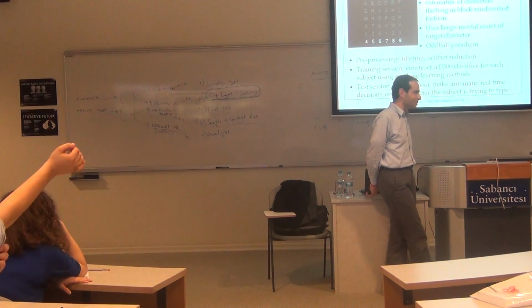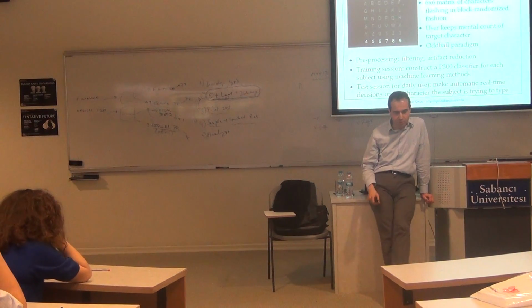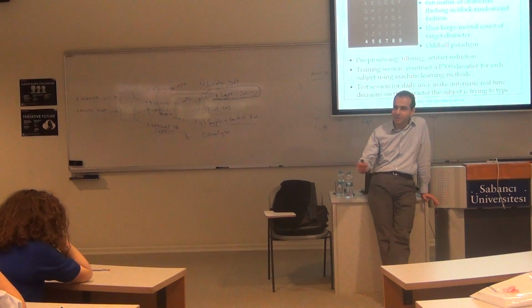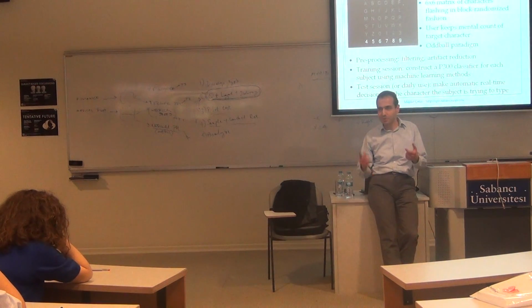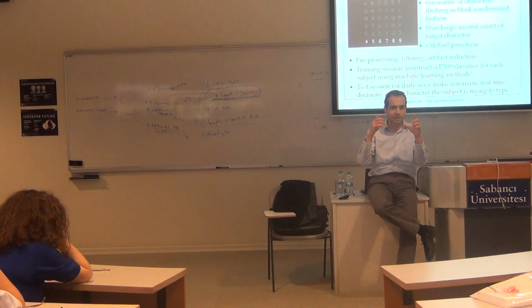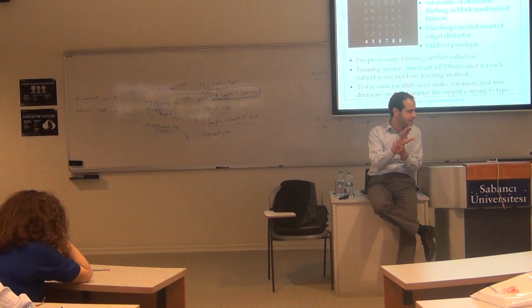Well, it is time consuming, of course. So basically, well, let me give you an idea. The system that I showed you at the start, or the current version of it, using a system of that form, we can type something like 20 letters per minute, which is slower than maybe handwriting, but it's better than nothing. The other thing is that there are the flashes, and then the system is working in the background at that time. And then when it's confident enough, it displays the result on the screen. So what we do is, and that's the repetitions I talked about.